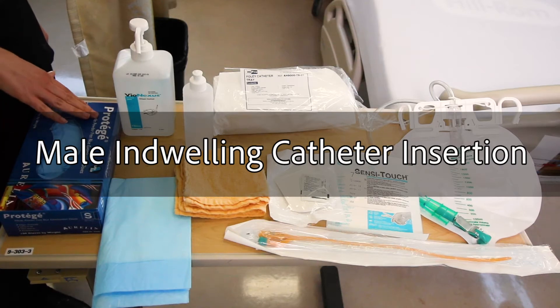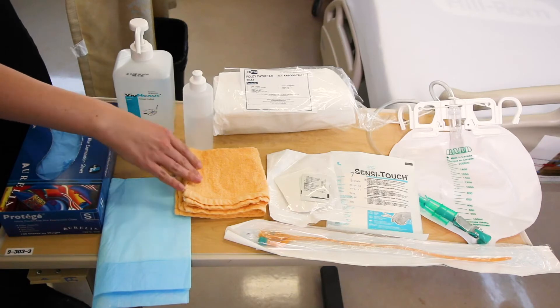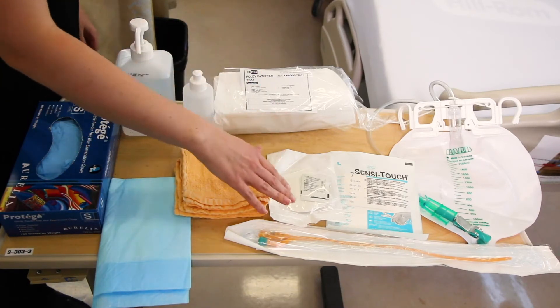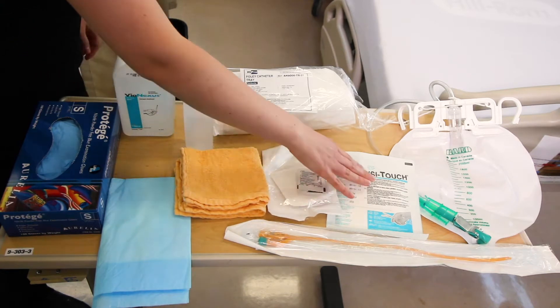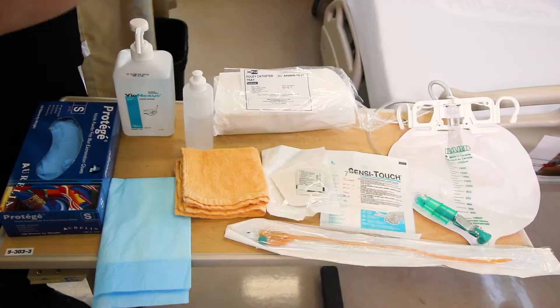You will need clean gloves, hand sanitizer, absorbent pad, peri care supplies, Foley catheter kit, catheter securement device, sterile gloves, Foley catheter, and urine drainage bag.